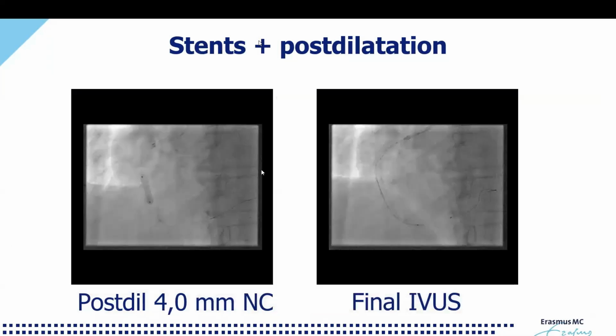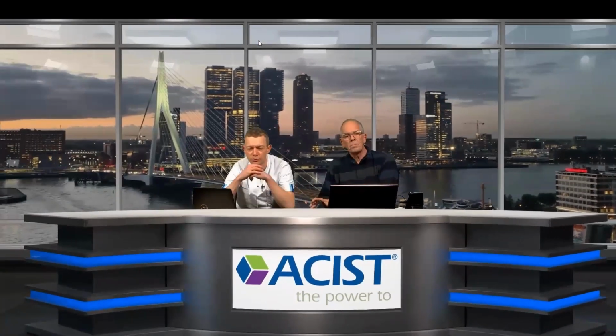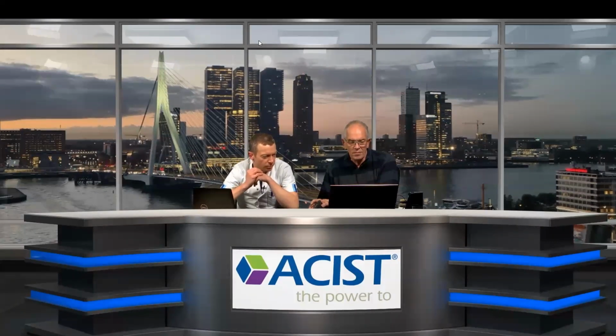Okay, Jürgen, I think we have a couple of final slides. I think we're nicely on time. We prepared 4 cases. This was the final angio. We have a couple of minutes left. You will ask yourself, well, shockwave is contraindicated for stents with underexpansion. The idea of today is not to do shockwave propaganda. I can attest to the fact that we use more atherectomy than shockwave in Thoraxcenter. But in these cases, we just selected a couple in which we used shockwave.